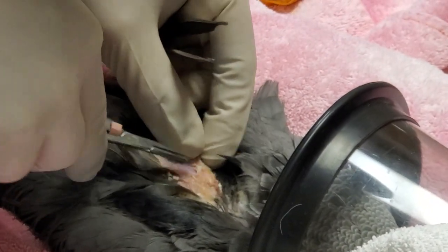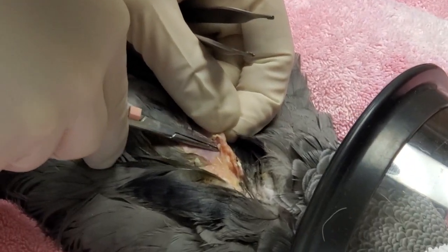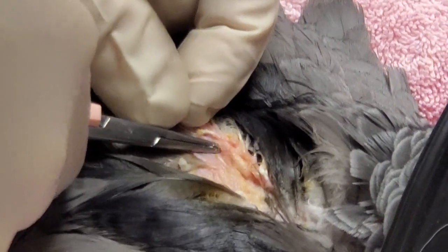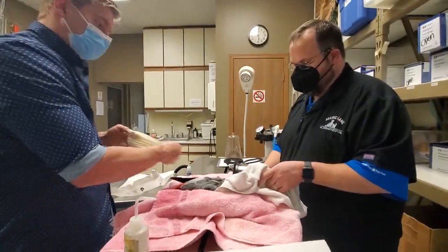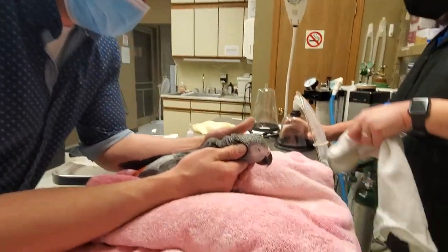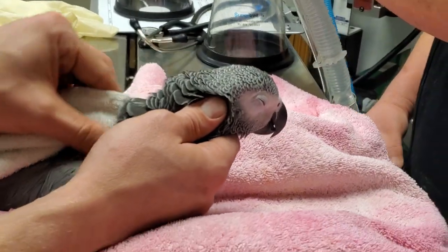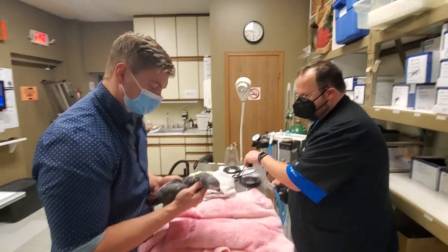There you go. Perfect. Then go ahead and do a drop of skin glue. Pinch to compress. Incision is closed and we can wake up. For the recovery, keep them upright and warm. Watch for respirations to continue at a steady pace. Go ahead and dry a couple of these feathers off. The hormone implant that was placed should help prevent her from having the destructive hormonal behavior that she's been showing.